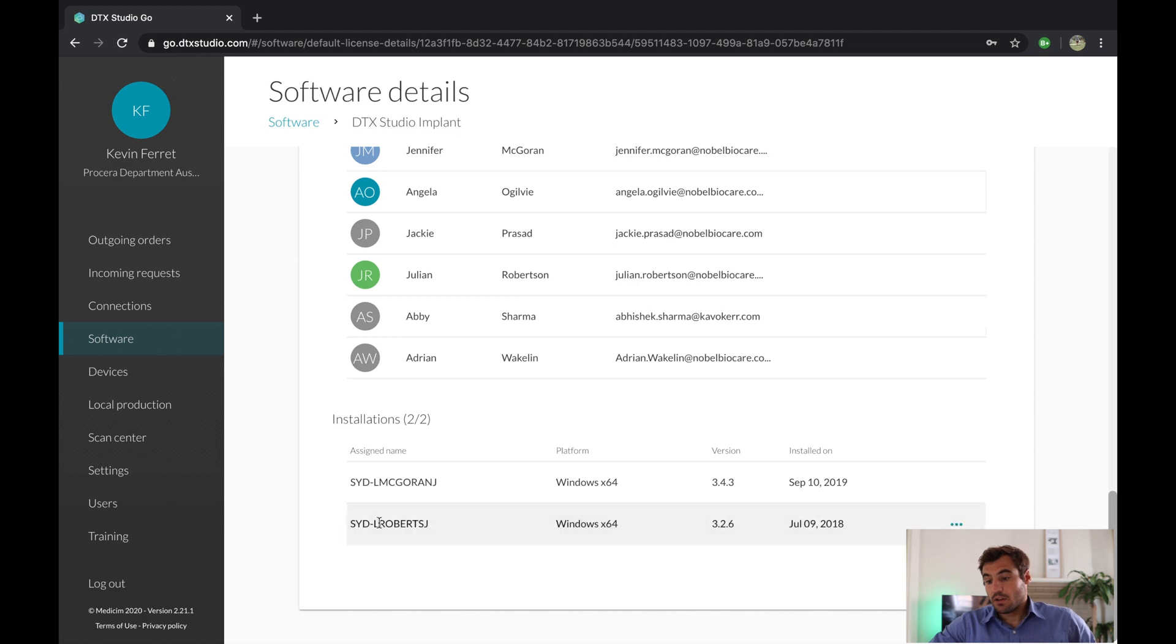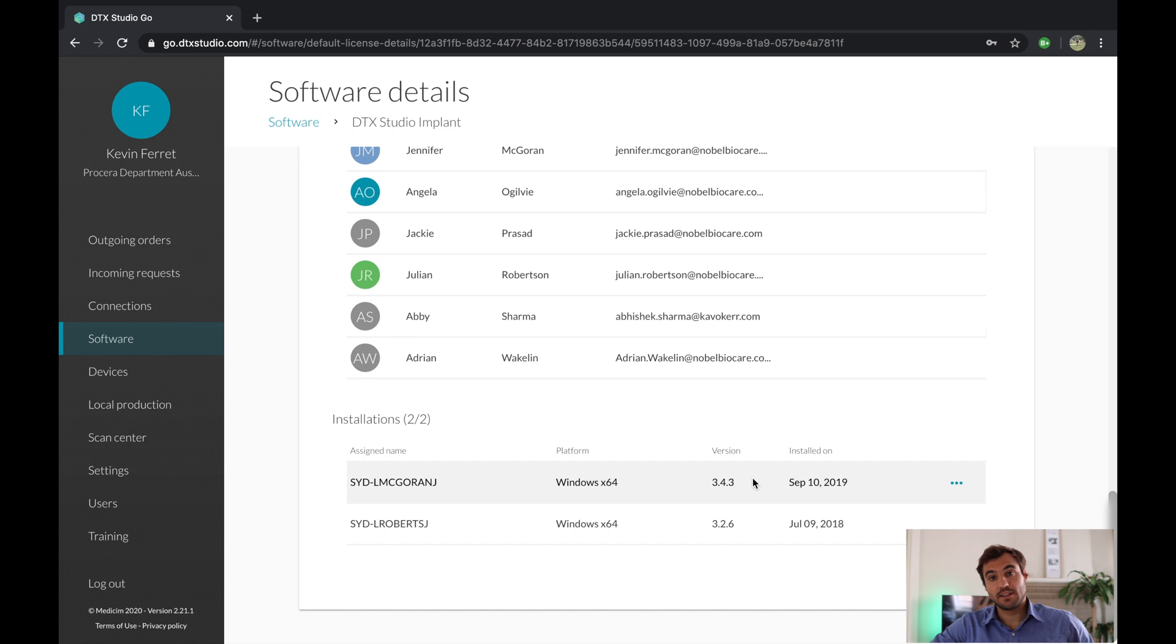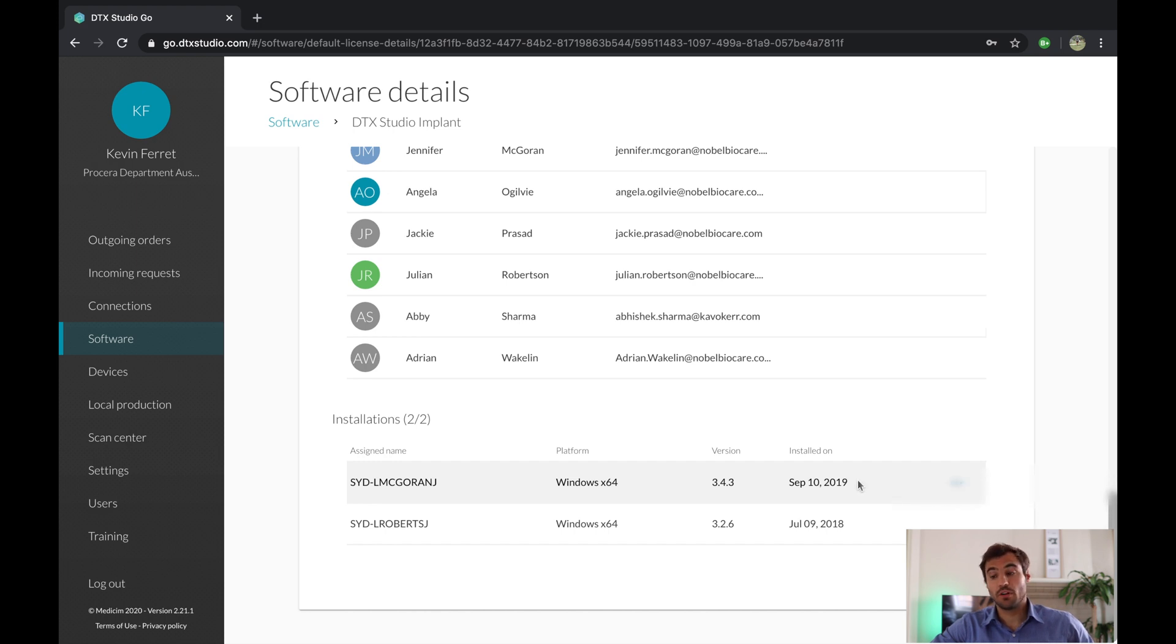So what we're going to do here, we're going to look at if we still have two installations available. Sometimes you might just update and have a new computer. If that's the case, click on the three dots here.